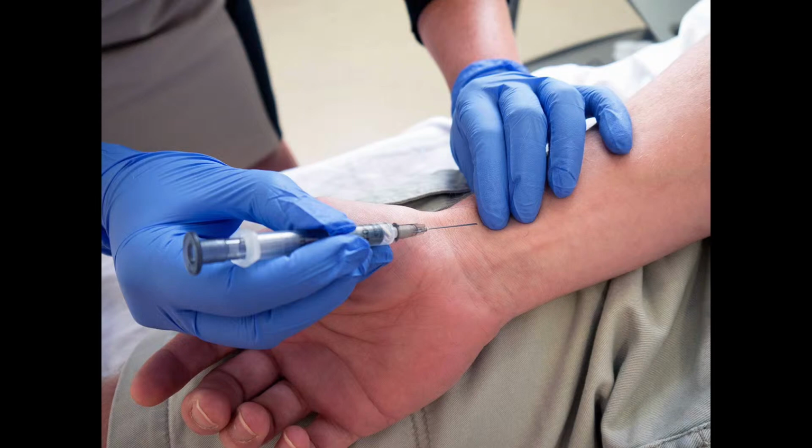This is to ensure that down the track, these sites can be monitored for signs of infection or occlusion or any other issues. And this is also something you need to note down if there are any future complications at all. Another pretty important one is to make sure that you write down or record the results of the actual blood analysis itself.